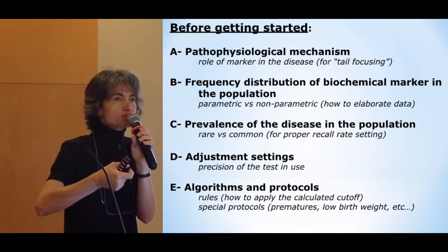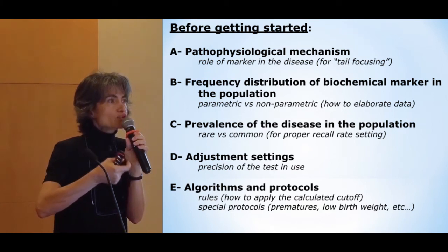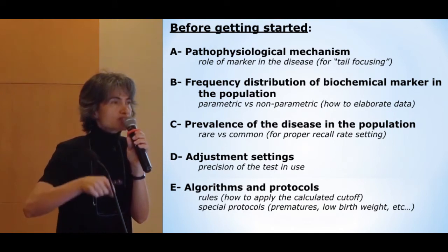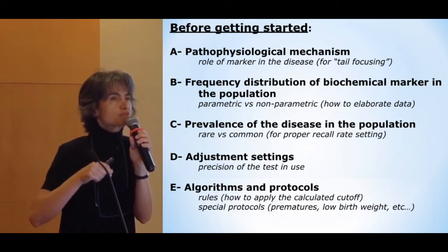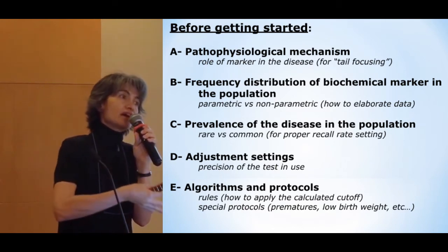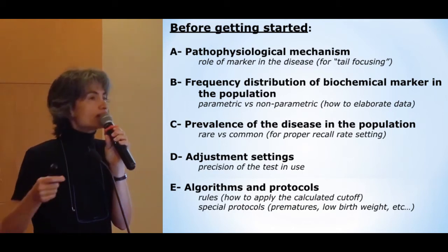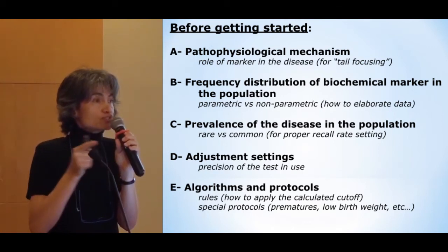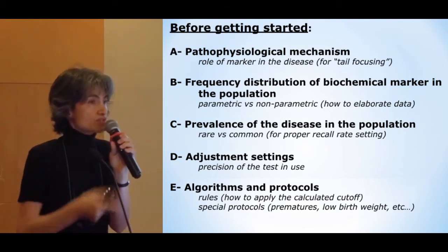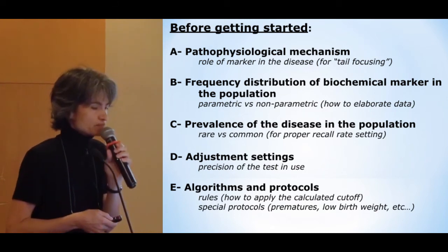If you have a spot spiked with, like, 10 microunits per milliliter of TSH, and you measure the TSH several times on the same spot, you don't get 10 every time. You might get 9.9 and then 10.3, okay? And you cannot neglect those values around your cutoff. How to take those into account? I'll show you one of the possible methods to do that.